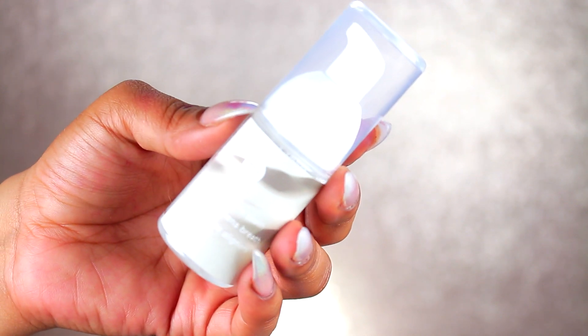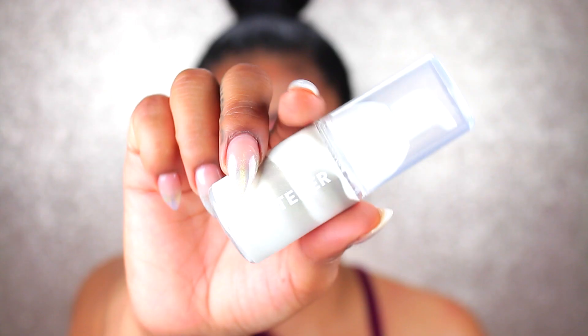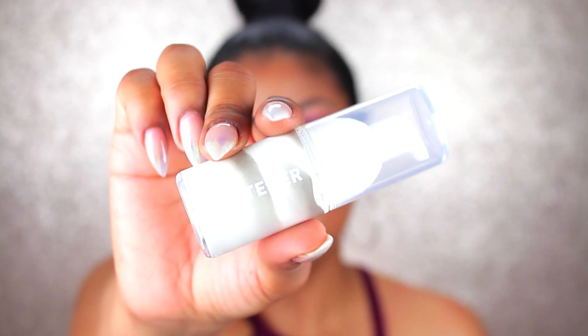Now they also included a whitening foam. This is going to help freshen your breath. It's also going to whiten your teeth, so you're able to kill two birds with one stone while achieving that fresh breath that you get nervous about when you think about having those aligners in. That was one of the first things I thought about — how's my breath going to smell when I have that on for so long. So I'm definitely happy about this.